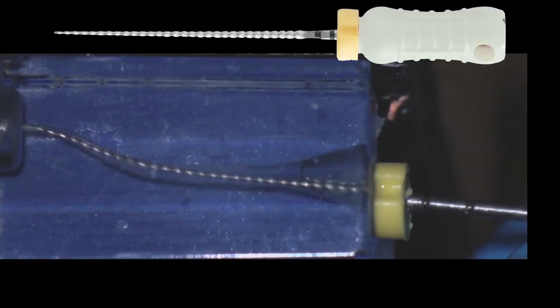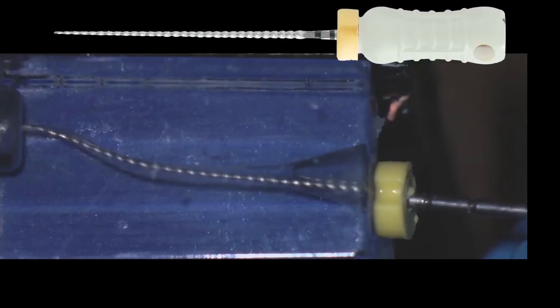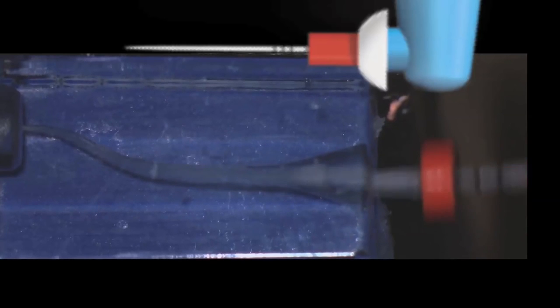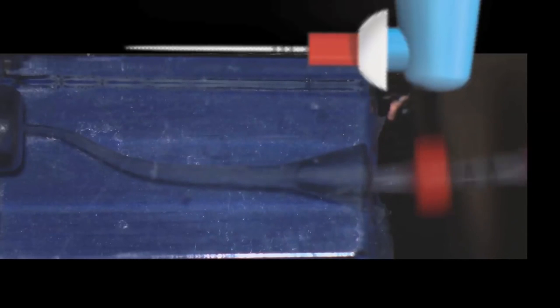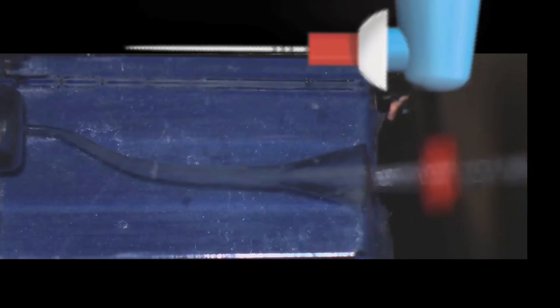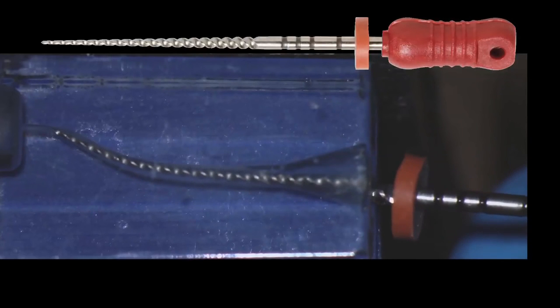After that, we will irrigate again, and now we go through the irrigation procedures. In this case, we're going to be using the EndoActivator with sodium hypochlorite, and then we will rinse the canal. Then we will use other solutions such as Q-Mix, or in another case, EDTA.